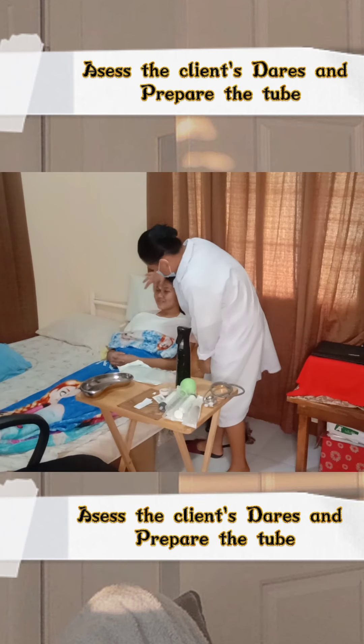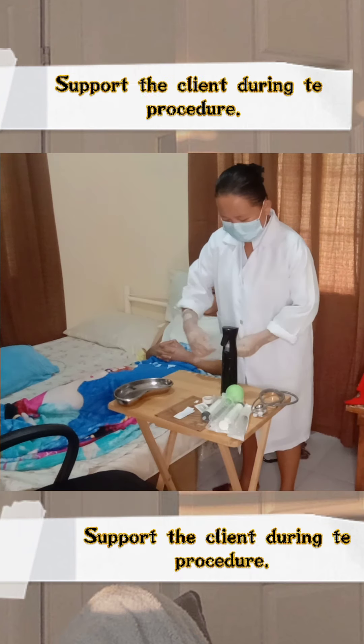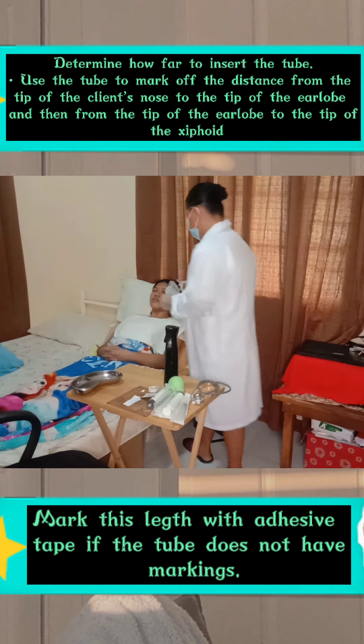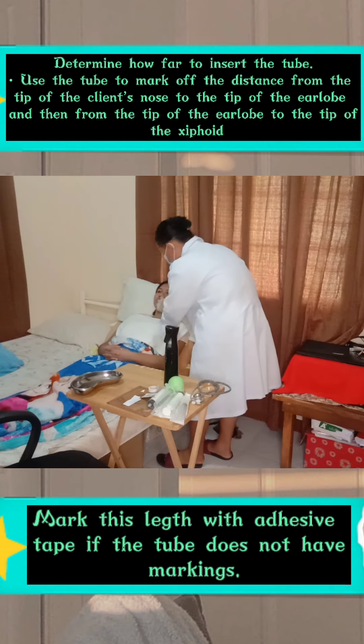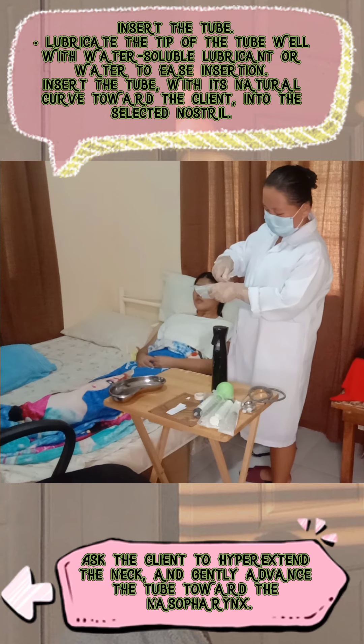Assess the client's nares and then prepare the tube, supporting the patient during the procedure. Determine how far to insert the tube by using the tube to mark off the distance from the tip of the client's nose to the tip of the earlobe, and then from the tip of the earlobe to the tip of the xiphoid process. Mark this length with adhesive tape if the tube does not have markings.